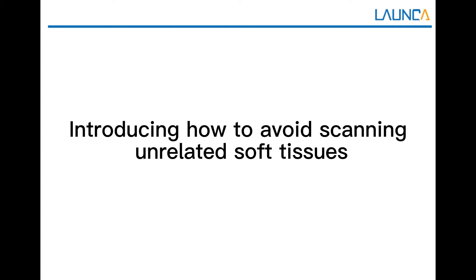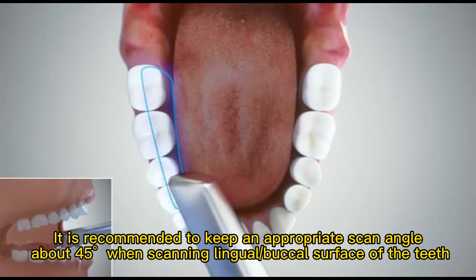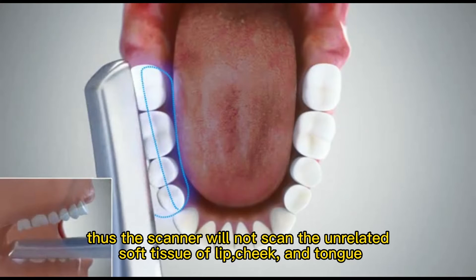Introducing how to avoid scanning unrelated soft tissues. The key point is the skin angle of the scanner and separating the scanning teeth from the soft tissue. It is recommended to keep an appropriate scan angle of about 45 degrees when scanning the lingual and buccal surfaces of the teeth. Thus, the scanner will not scan the unrelated soft tissue of the lip, cheek, and tongue.